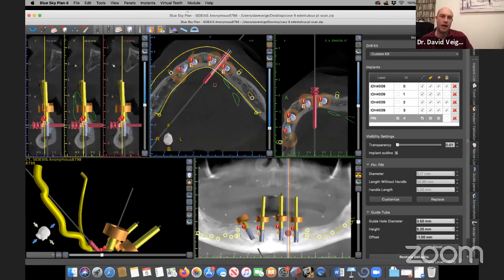Okay. Next question. The final prosthetic design for the case that you showed with the 4 implants on the lower was a zirconia hybrid. Do you use bars or overdentures or bar acrylic or trilure? So I have done every restoration that you could possibly think of except trilure.